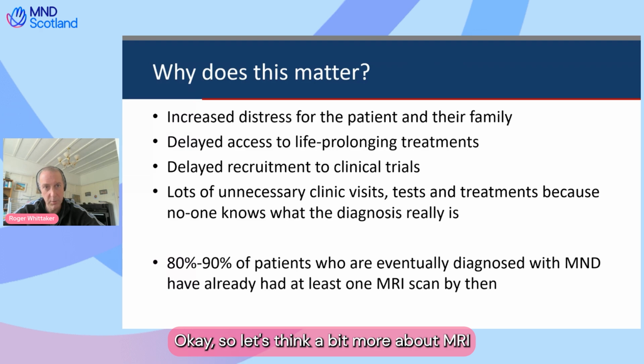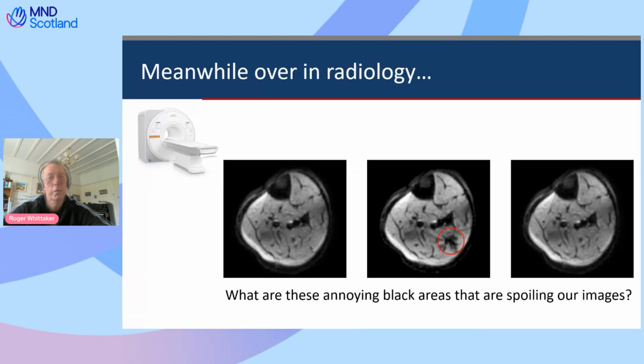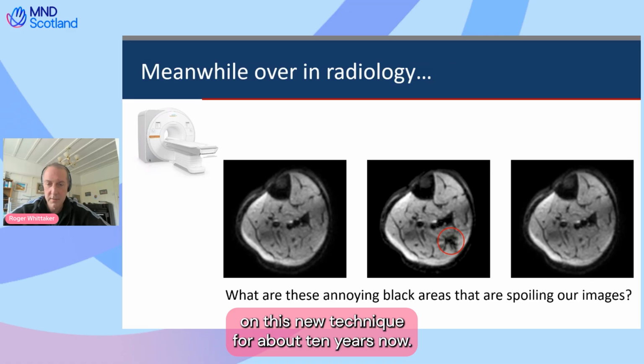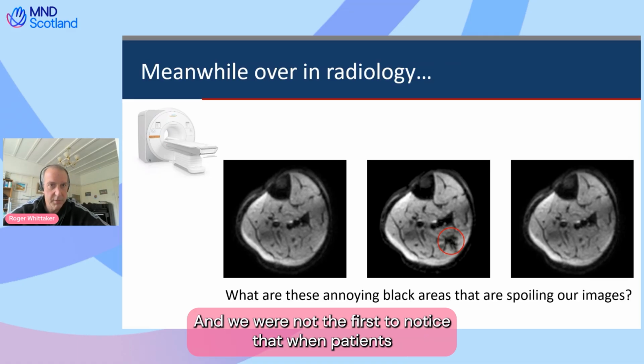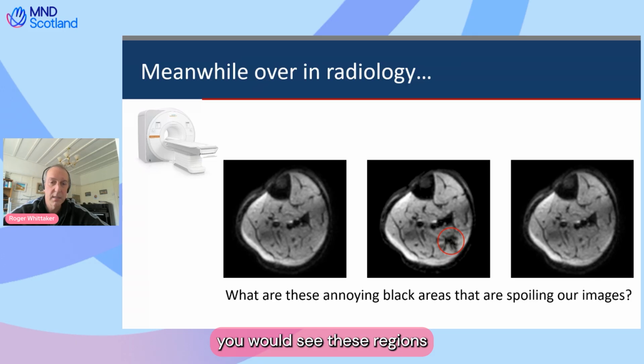Okay, so let's think a bit more about MRI scanning. So we've been working on this new technique for about 10 years now, and we were not the first to notice that when patients were having MRI scans of their muscles, occasionally you would see these regions where the image just disappeared.